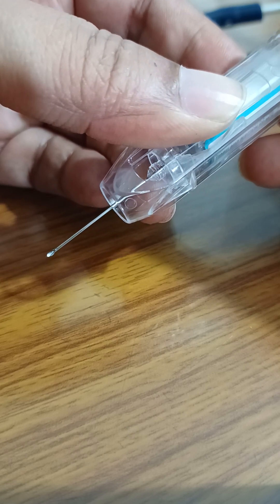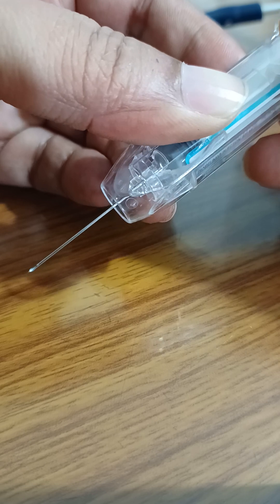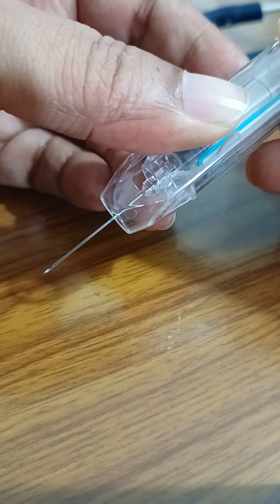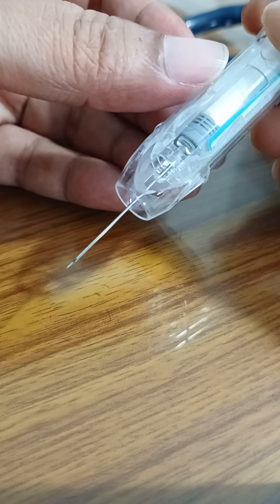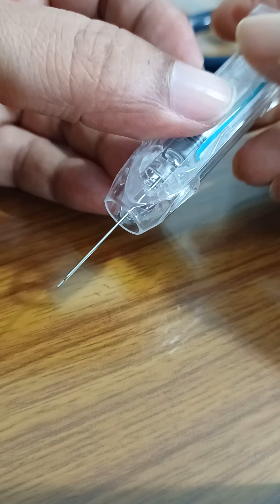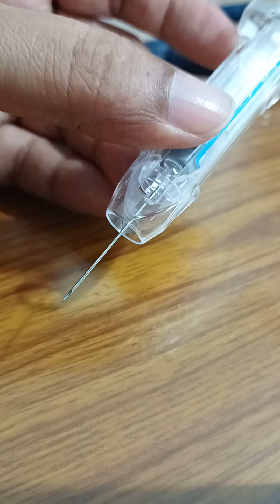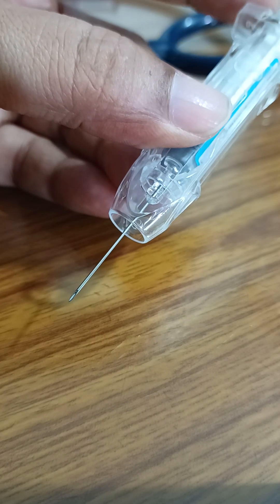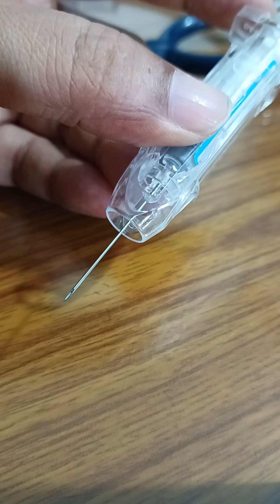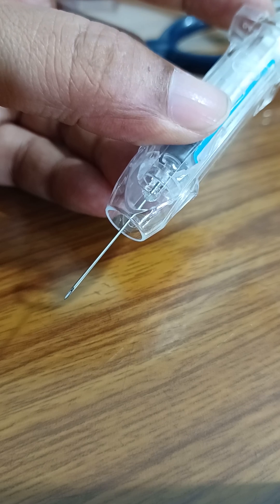Once the length of the needle is adjusted as per the build of the patient, we remove the air inside the syringe and then give the medicine intramuscularly, preferably in the deltoid.